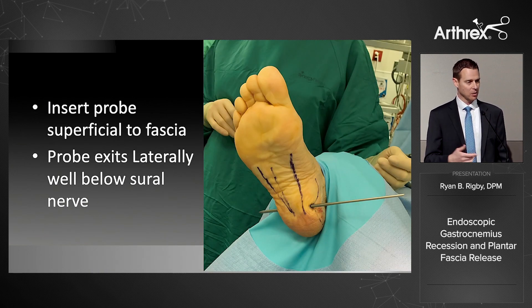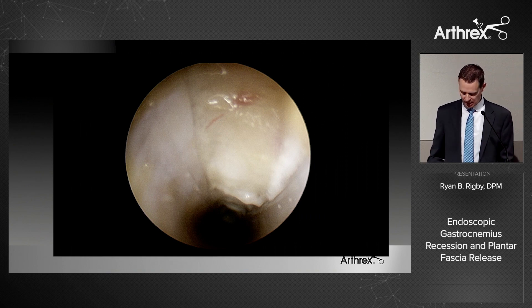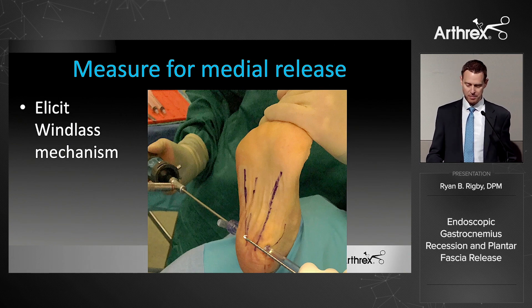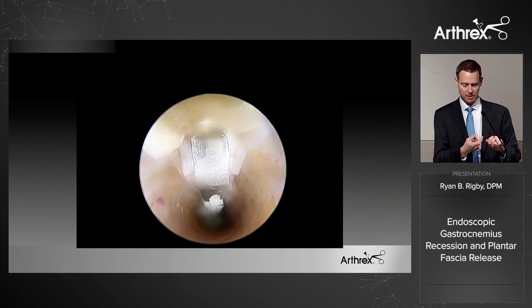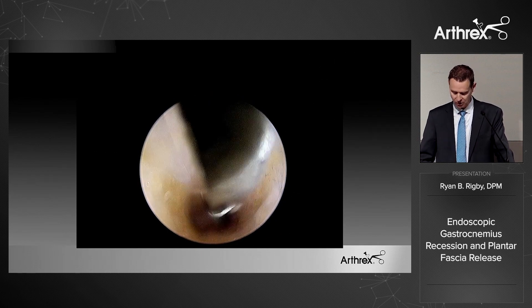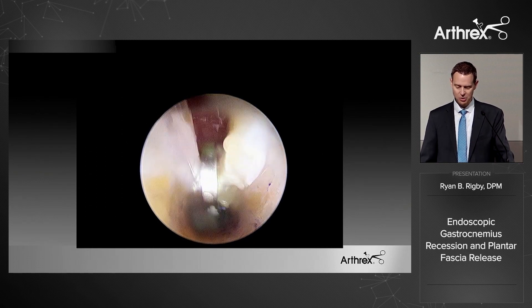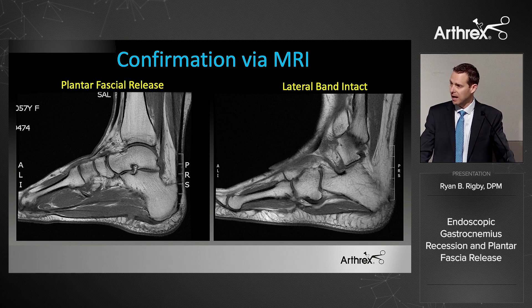The probe exits the lateral side well below the sural nerve; insert the cannula — it slides over easily — then insert the scope. If there's tissue on the fascia, the kit includes a rasp to clear it for better visualization. Elicit the windlass mechanism and measure for the release. I usually insert the scope from the lateral side, coming in medially, and find a small herniation of tissue that marks the right amount to release the medial portion, revealing the underlying intrinsics. Sometimes thick chronic fasciosis requires a couple of passes. A post-op MRI confirmed the medial release with the lateral band left intact — important for success.